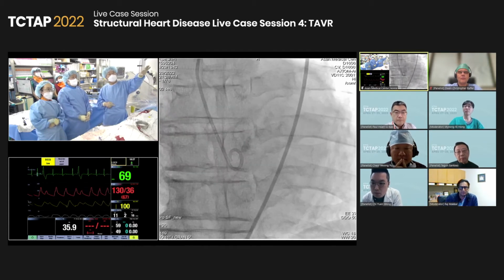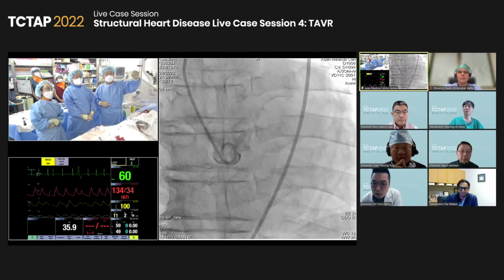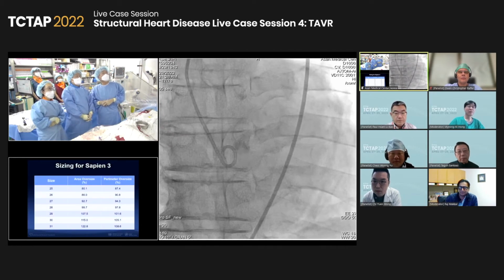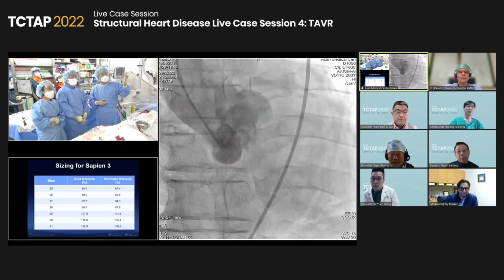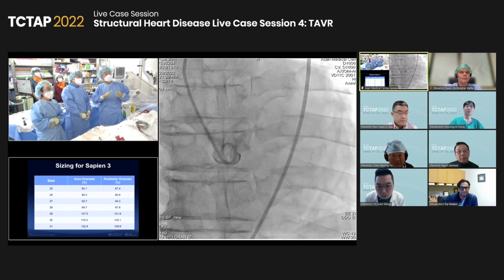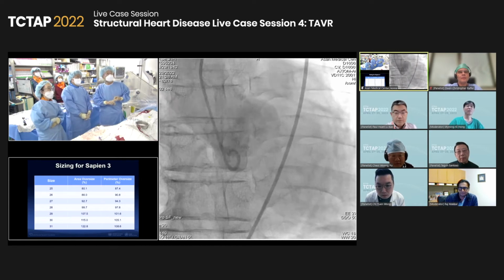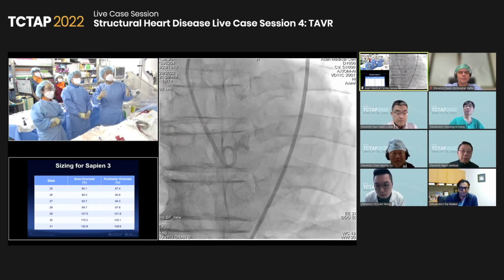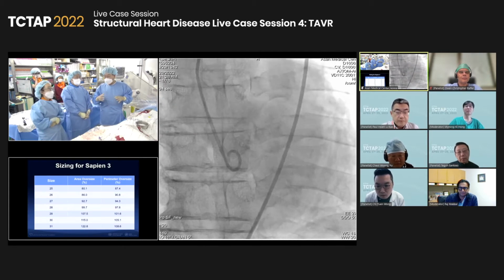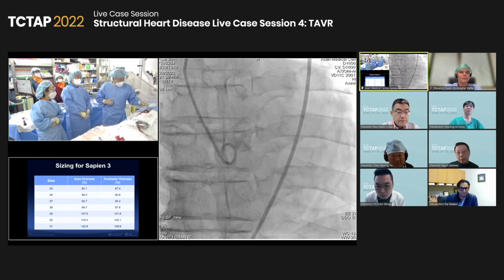Would you show us the CT again, the size selection? All right, great. 29. Dr. Anzu will discuss: you choose a SAPIEN, right? Yeah, a balloon expandable. And in terms of sizing and device size selection, would you discuss that one?